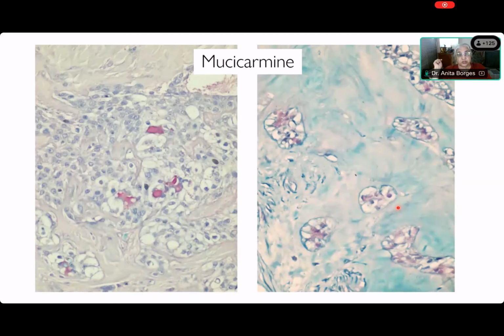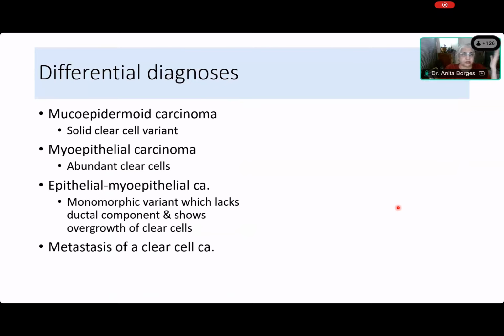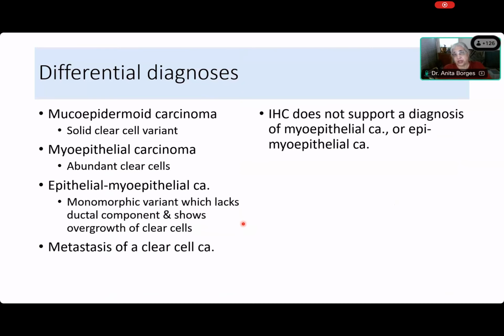Okay. Now this tumor also, by the way, contains mucin, and you can see it. Not all the cells contain it, and therefore people could mistake it for, what can you mistake it for? A mucoepidermoid tumor. Okay, but it does not have intermediate cells, and it doesn't show you squamous differentiation. It is a very close mimic of a mucoepidermoid carcinoma. Okay? So then you have differential diagnoses, myoepithelial carcinoma. No, but we have now come down to an understanding that it is none of these tumors. The immunohistochemistry does not support a diagnosis of a myoepithelial carcinoma or epithelial myoepithelial carcinoma.